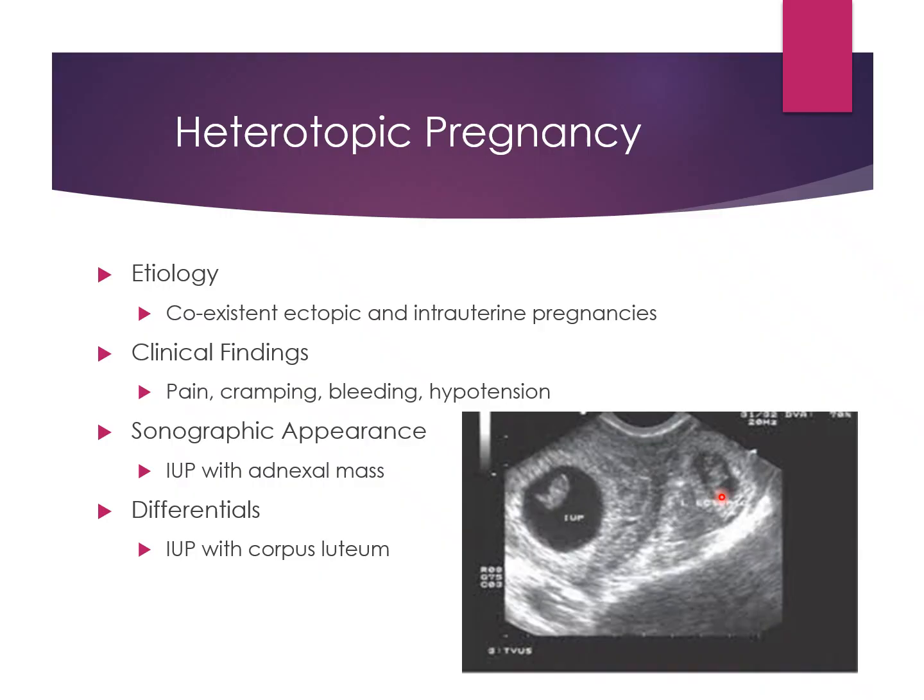So just make sure that this is truly an ectopic. You need to see a yolk sac or a fetus, and then some color. If not, just denote on your worksheet complex mass seen right ovary, ring of fire, those sounding alarm verbiage that we use to signify something is wrong.